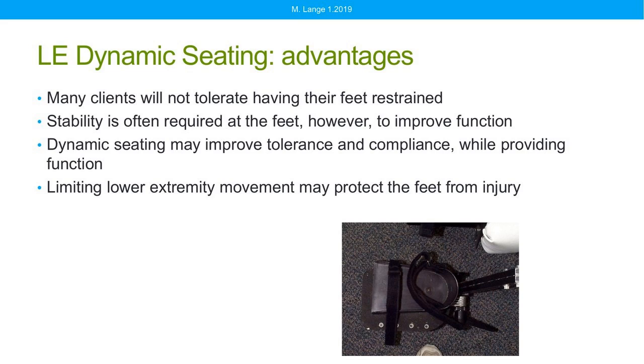And if we're using dynamic movement at the legs, it's critical that we strap those feet, attach those feet to the foot plate. Otherwise, the client will extend and their feet will simply slip right off of the foot plate itself.